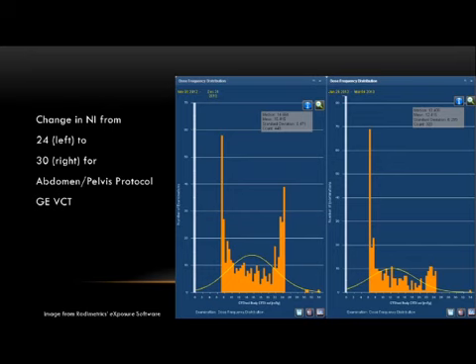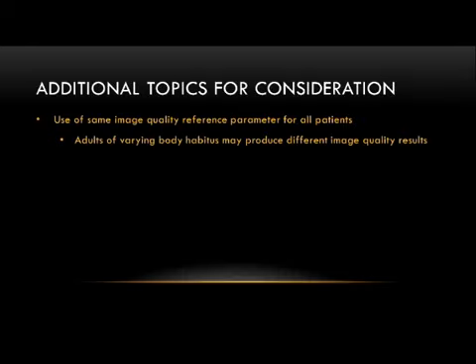So again, we had fewer maxing out at our maximum tube current that we had set, but we started to have some not so great scans down here, and our CTDIvol went from 15 down to 12. And our radiologist was like, you know what, actually, okay, I had already pretty well optimized the VCT. Let's go back to this setting. And now this is actually where our Philips is at. So those two scanners are matched now pretty well for CTDIvol and image quality.